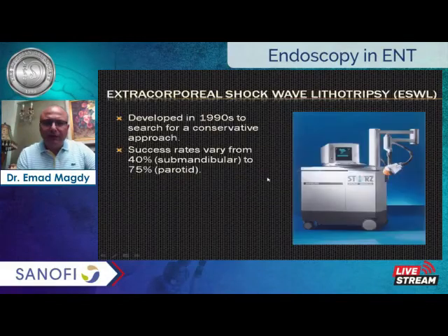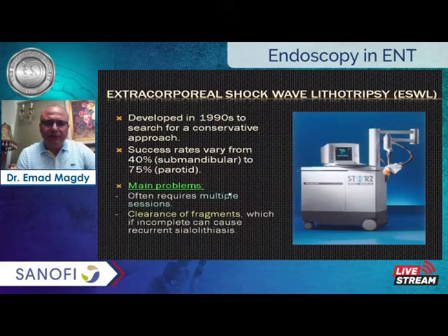Although the extracorporeal shockwave lithotripsy is very popular in urology, its success rate is much less in salivary stones. It's about 40% in submandibular, 75% in parotid, and the main problem is that it often requires multiple sessions. The main problem is actually the clearance of the fragments, because after you break your stone, you have the fragments in, so you have to go with sialendoscopy to get your fragments out.